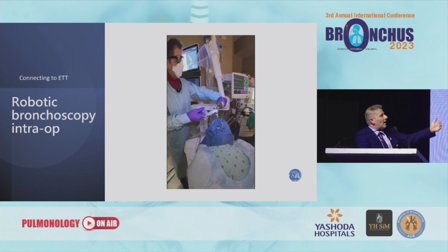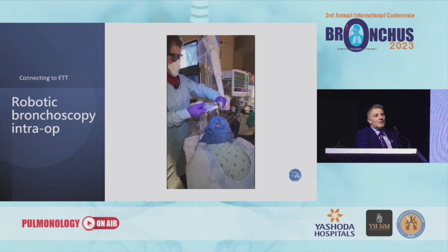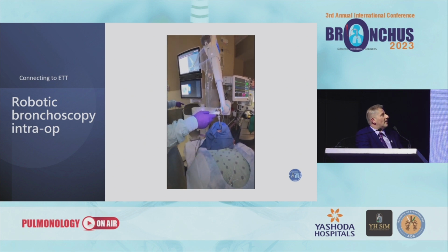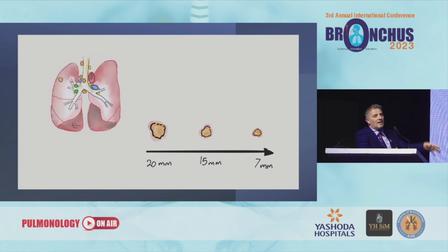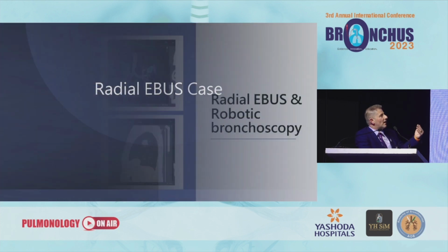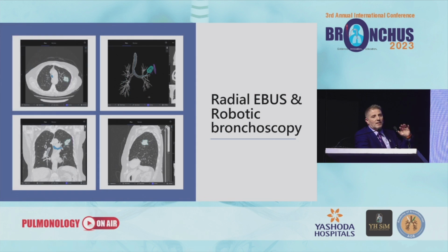And then you have the docking, when you dock with the ET tube, and then you put the catheter in, and that is when you start. So with that, I can start with the cases now, for example, using only the radial EBUS first.